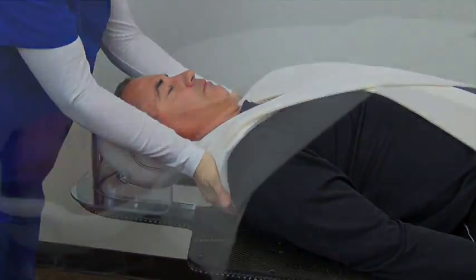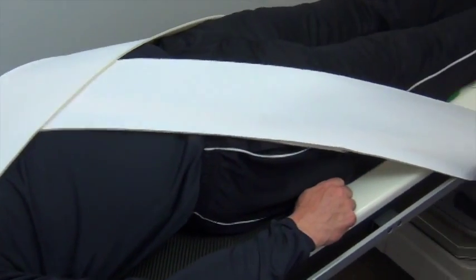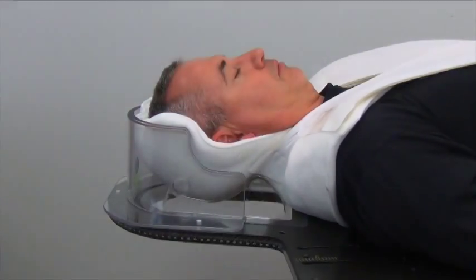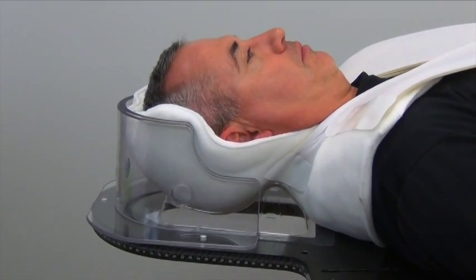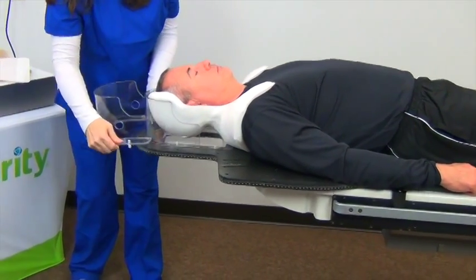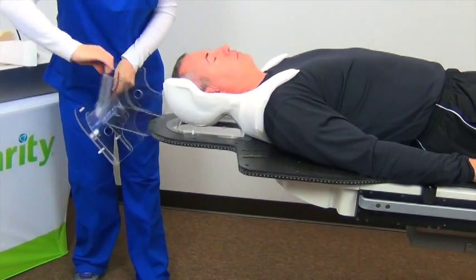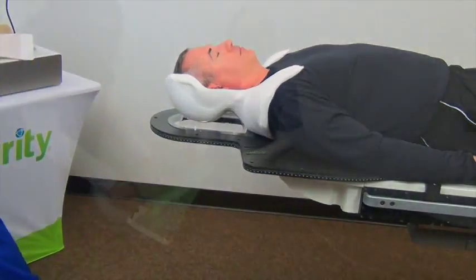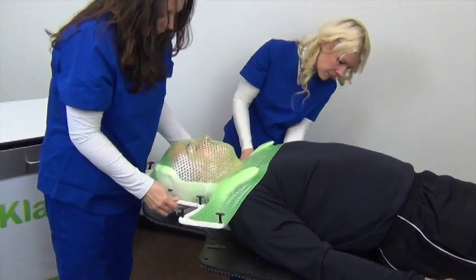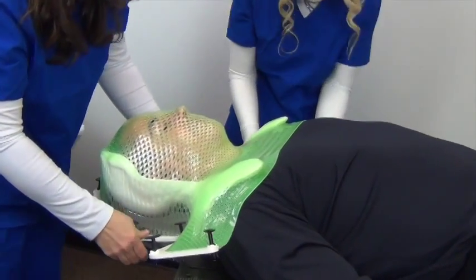You can also use a heat gun or hair dryer to reheat the cushion if needed. The shell cushion will harden completely, creating an ultra precise and secure full circumferential head support. Once the shell cushion is fully cool and rigid, remove the strap system and molds. You're now ready to prepare your thermoplastic mask, placing the mask over your patient's face and around the cushion for a highly stable and accurate head support.